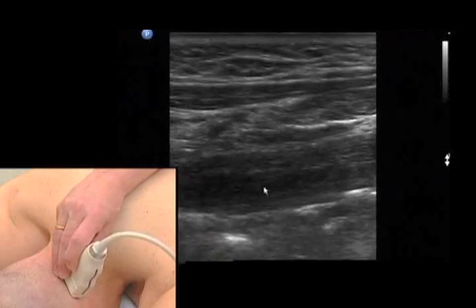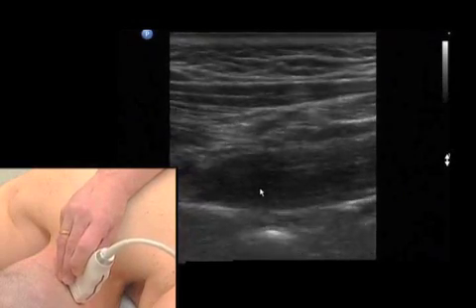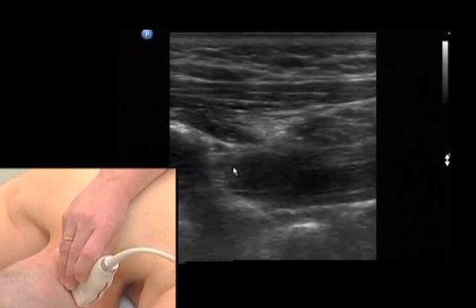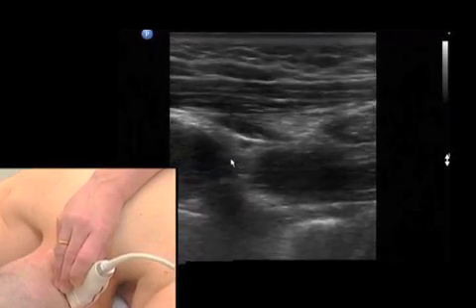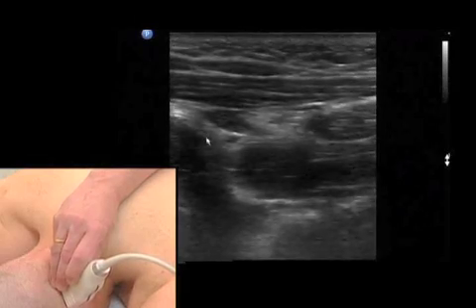And if we follow this muscle laterally — I do it until I reach the transverse process of atlas — you see the whole extension of that muscle. And now I move lateral and lateral and lateral and see the transverse process of atlas.